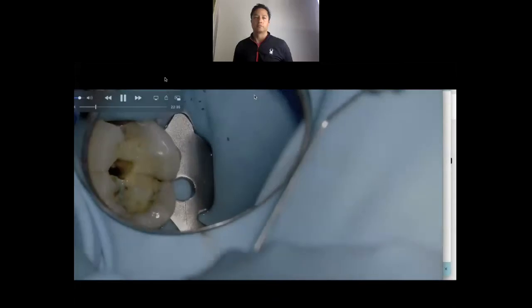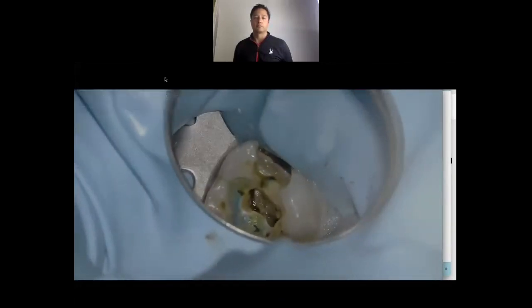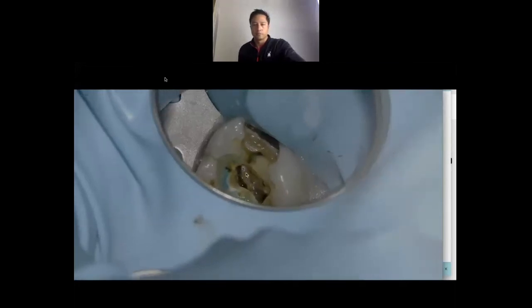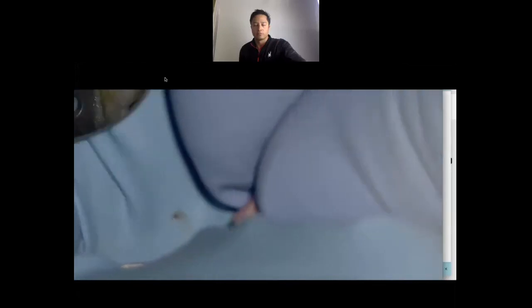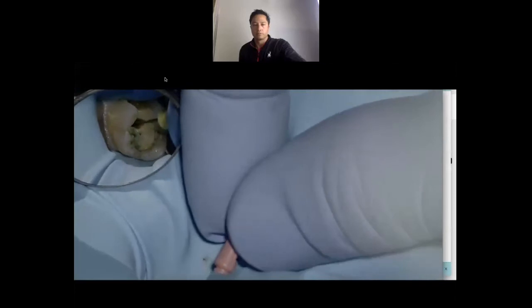What this does as well — once I remove the coronal two-thirds of that pulp tissue, all of a sudden the hemorrhage stops and you're not battling to get your files in there. Even if you use an SX and open up the orifice, that pulp is irritated and just continues to hemorrhage. So now I've opened up the coronal two-thirds. I'm going to take my number six file — I've honestly started to use a number six file routinely rather than starting with an eight.